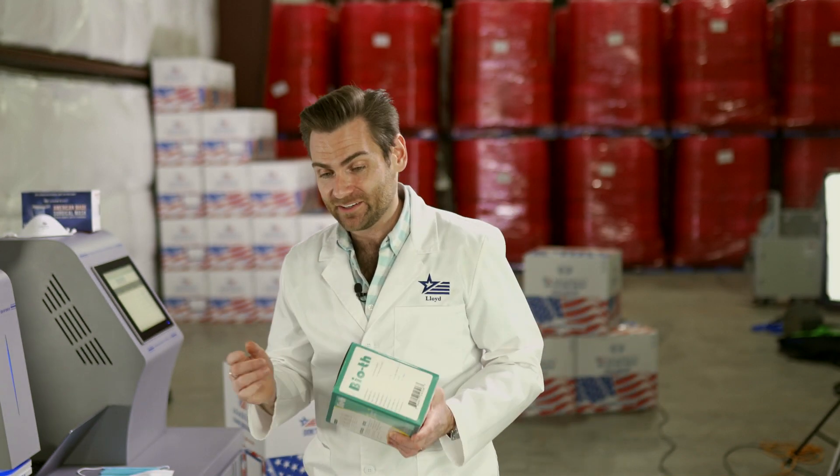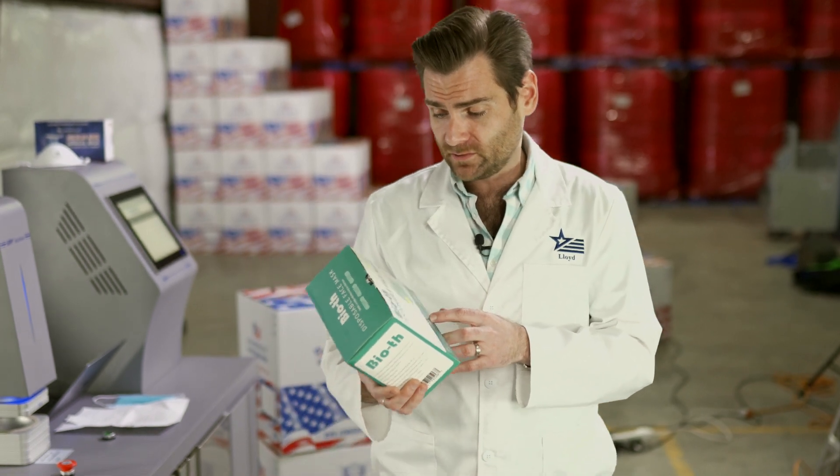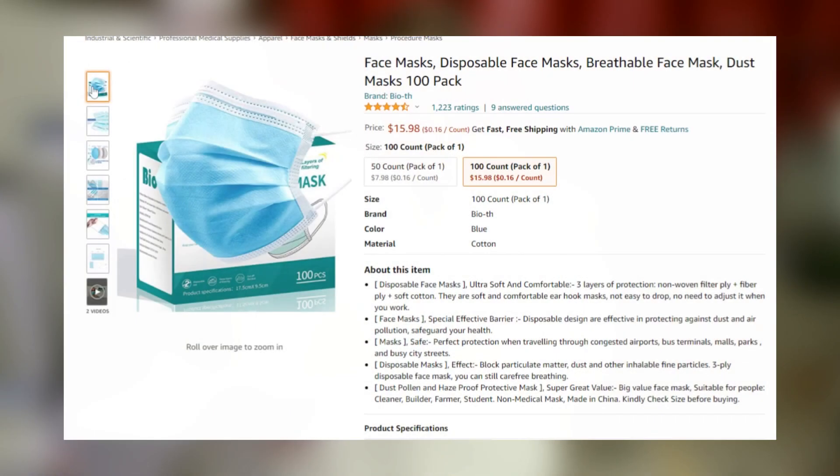All right everybody, thank you for joining today. We are testing every single mask on Amazon, which I think I bit off a little bit more than I could chew. But for this video we're looking at the Bioth disposable face mask — this is a giant hundred-mask box; I've never seen a box like this for disposable face masks.